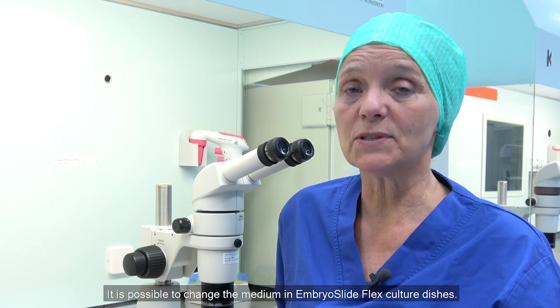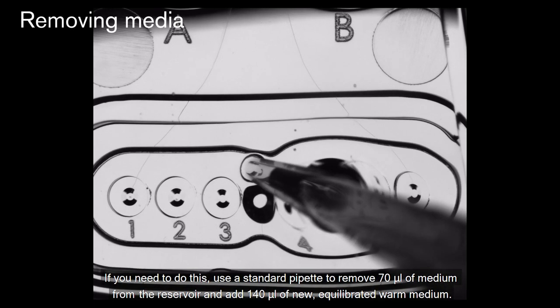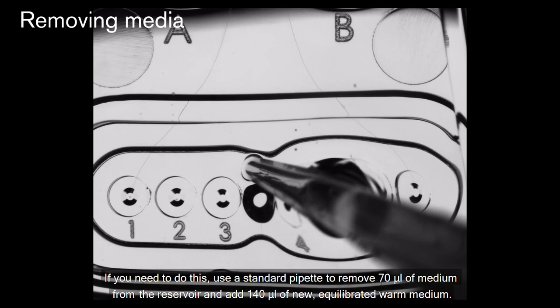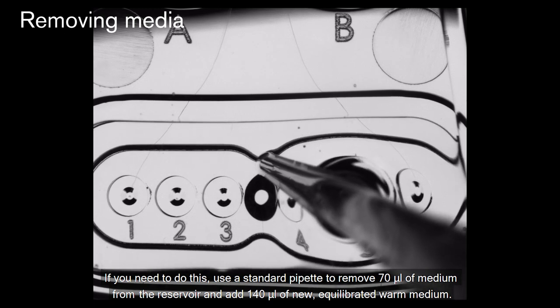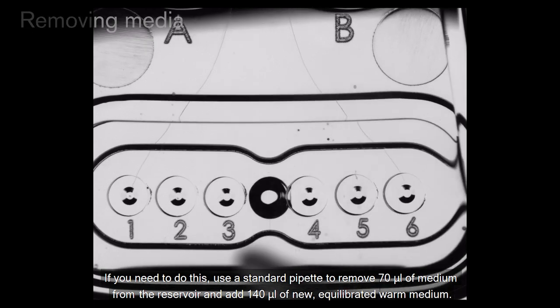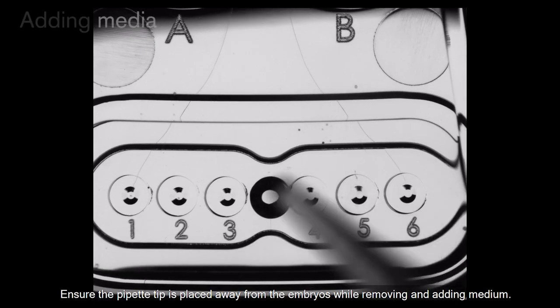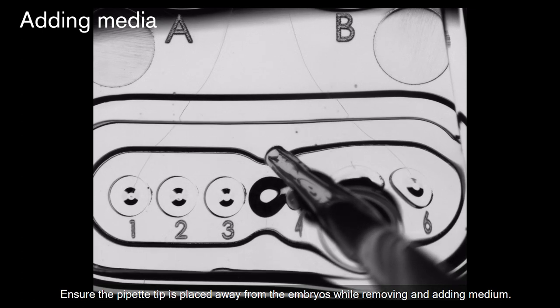It is possible to change the medium in the EmbrooSlide Flex culture dishes. If you need to do this, use a standard pipette to remove 70 µL of medium from the reservoir and add 140 µL of new equilibrated warm medium. Ensure the pipette tip is placed away from the embryos while removing and adding medium.